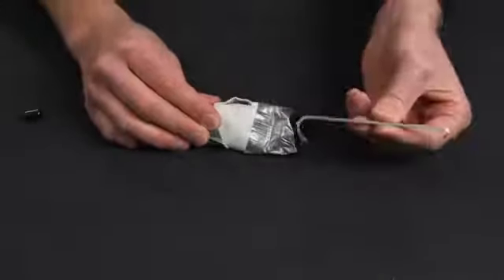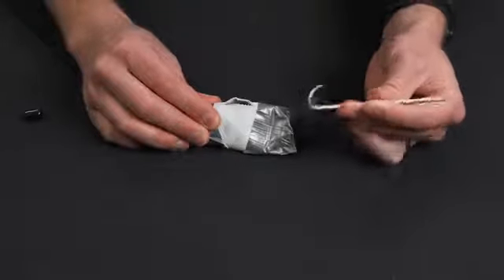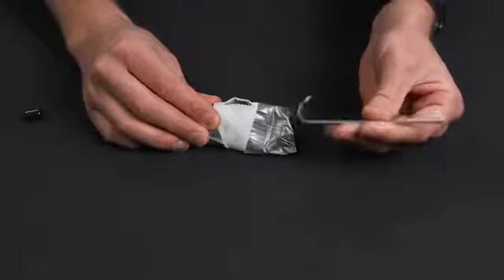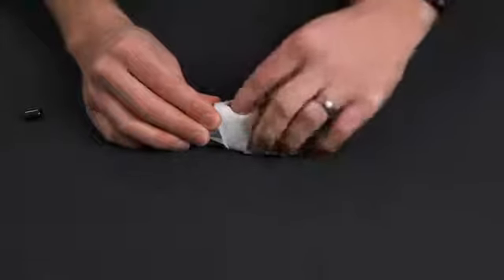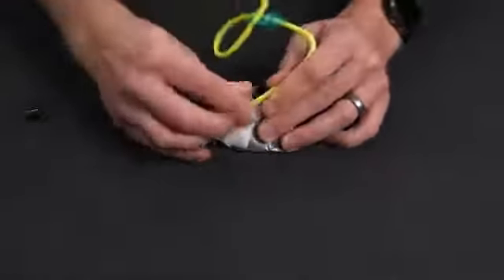Like I said, I do not use trach hooks. I really haven't been extensively trained in them. I think it's something that's a little bit cumbersome, and I have better luck just using my finger as a placeholder and inserting the bougie on the other side.